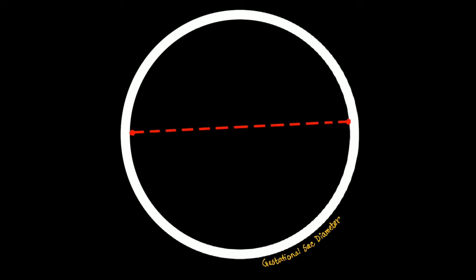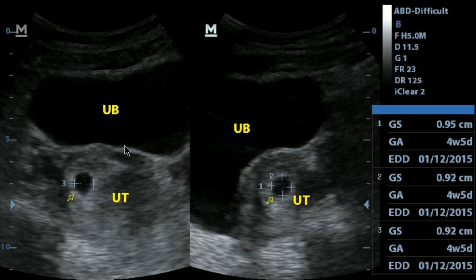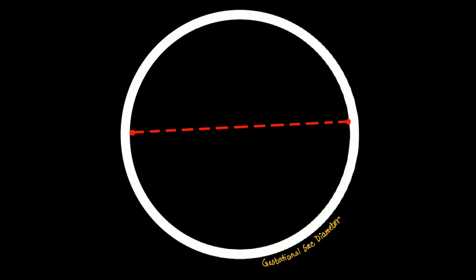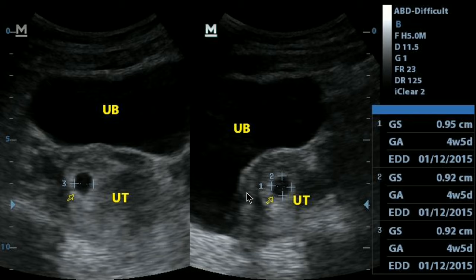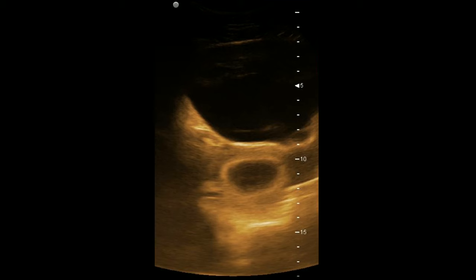Firstly, the gestational sac diameter. At the 5th or 6th week, you can get the gestational sac as a round cystic structure on longitudinal or transverse view. Click on the GSD or GS button of your machine and measure a diameter of the sac from inner border to inner border — this is the gestational sac diameter. Remember that we measure lumens inner to inner and solid structures outer to outer. I have measured inner to inner by pressing the GS button. All measurements showed the sac size of 9 mm, corresponding to 4 weeks and 5 days of gestation.